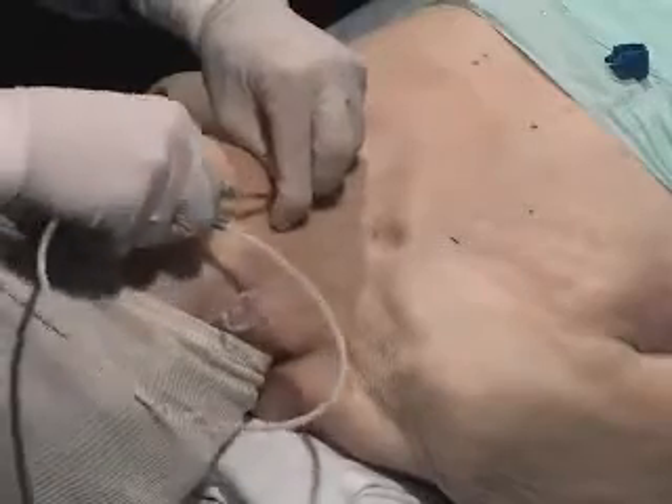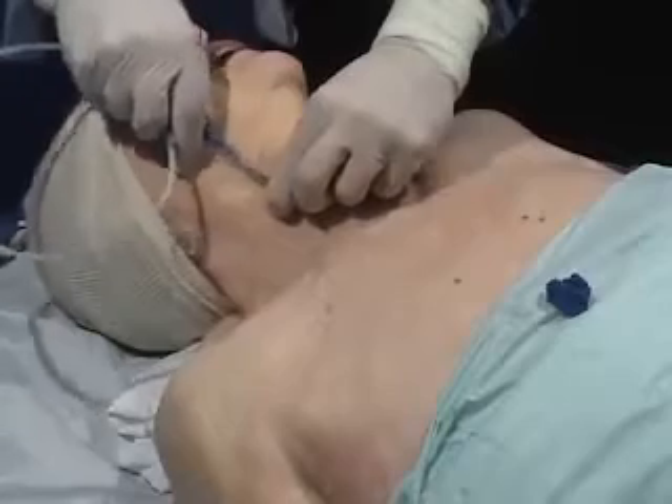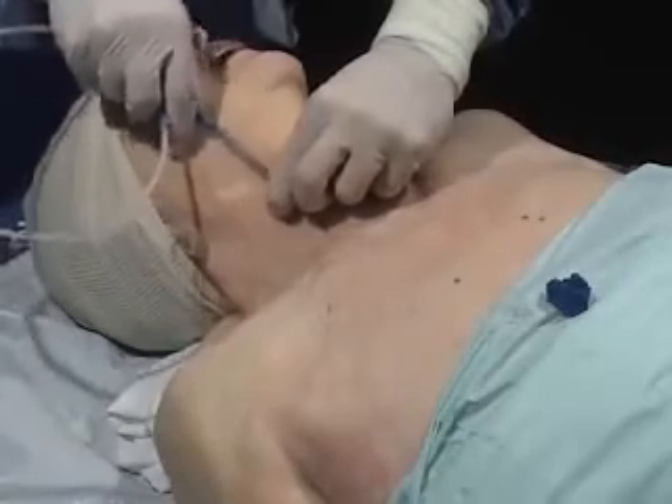The wire is gently introduced. If resistance is encountered, it should be removed and the vein must be relocated.